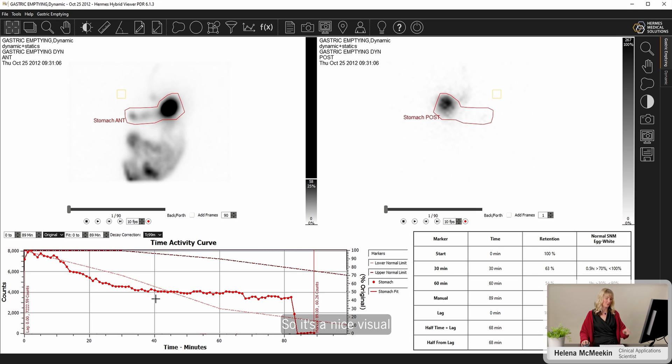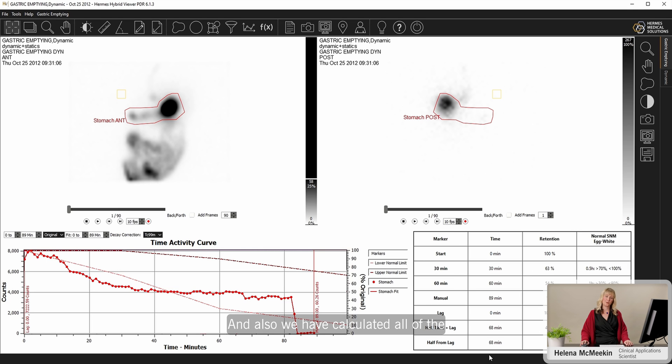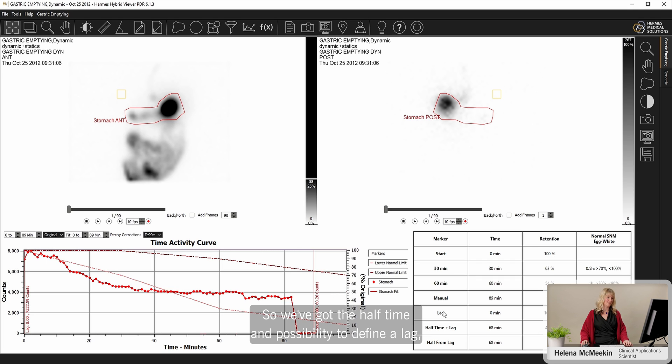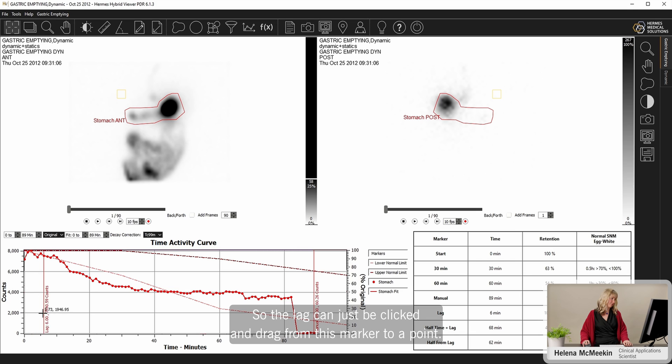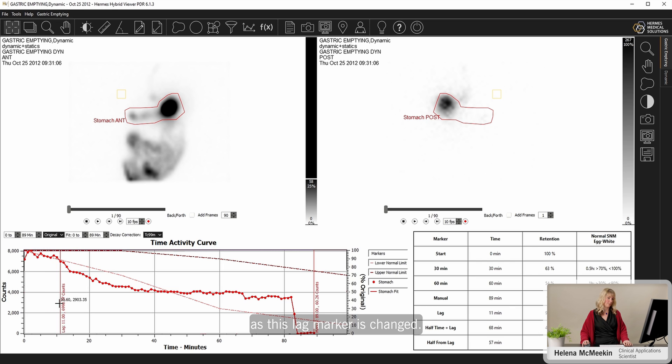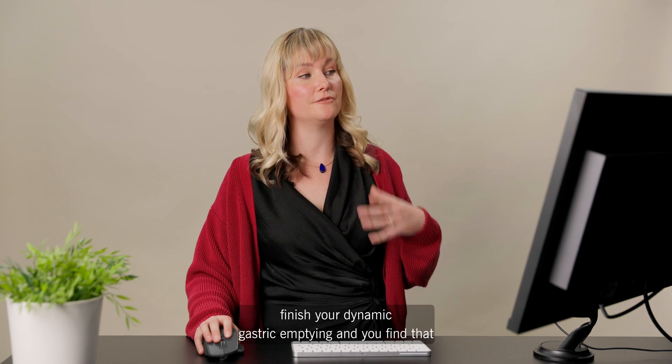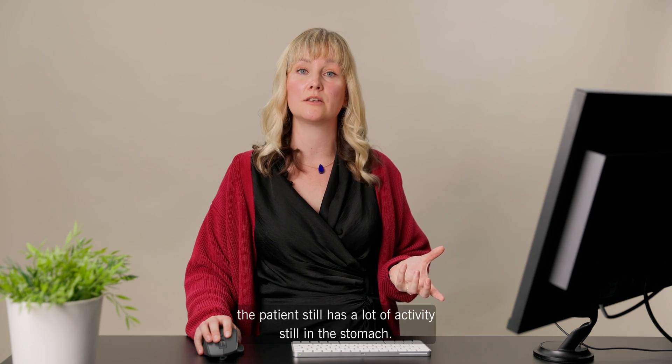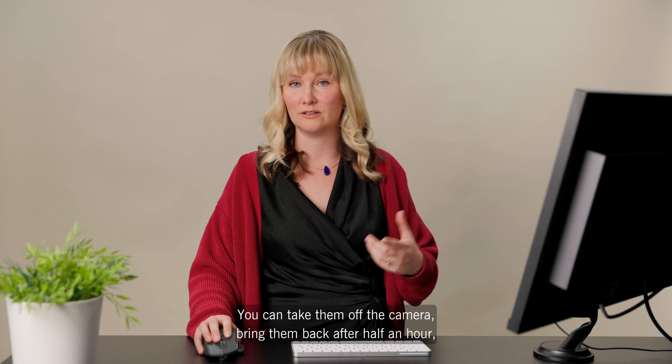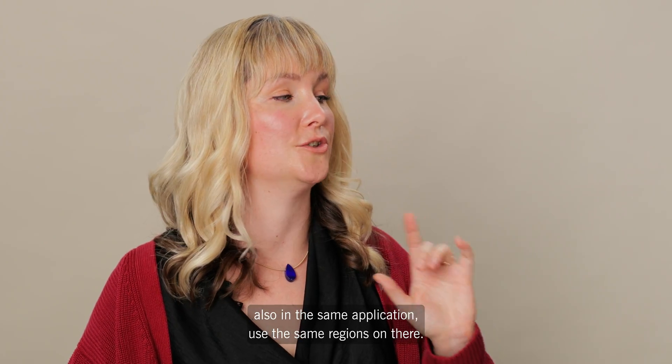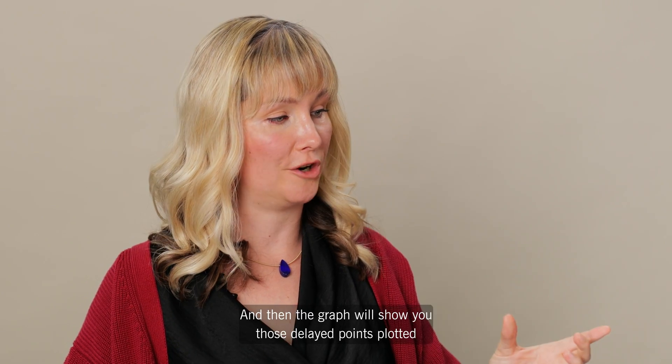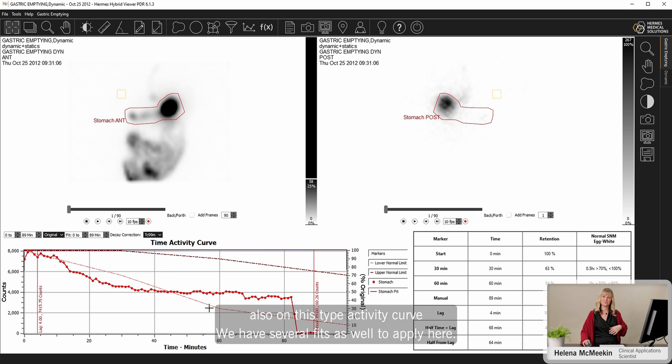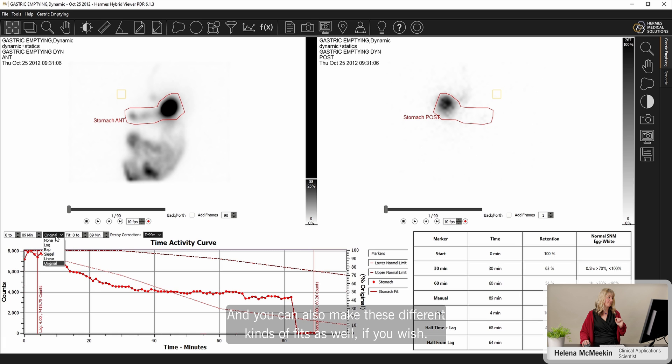And so it's a nice visual guide there for whether or not the patient gastric emptying is normal. And also we have calculated all of the results you'd expect from a gastric emptying study. So we've got the half time and possibility to define a lag if you wish. So the lag can just be clicked and dragged from this marker to a point. And you can see here that the table is live updating as this lag marker is changed. If you have delayed static images, so if you finish your dynamic gastric emptying and you find that the patient still has lots of activity still in the stomach, you can take them off the camera, bring them back after half an hour, an hour, two hours. And then you can actually put those images, those static images, also in the same application, use the same regions on there. And then the graph will show you those delayed points plotted also on this time activity curve. I have several fits as well to apply here. It's doing a decay correction for the tracer that you're using. And you can also make these different kinds of fits as well, if you wish.